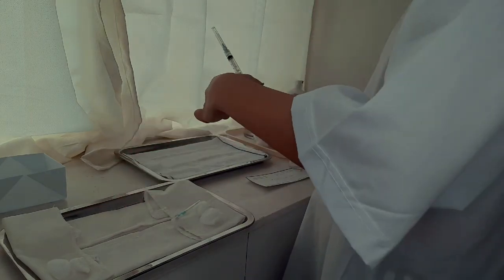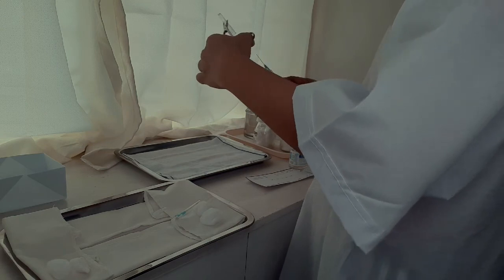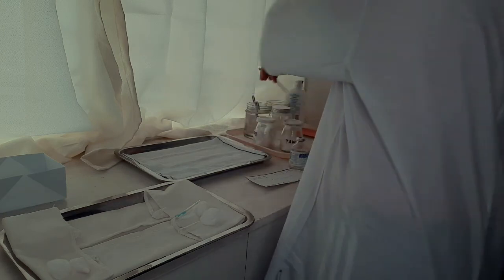Since the gauge 23 aspirating needle is already attached to the syringe, there is no need to change the needle at this point. Instead, proceed to aspiration of 0.5 ml air and inject it into the vial.